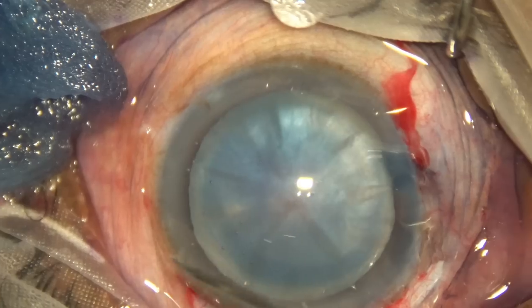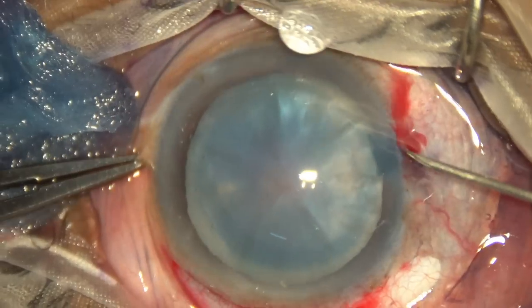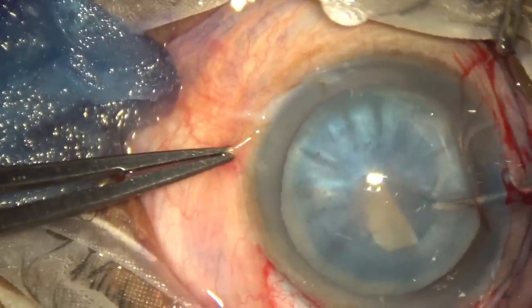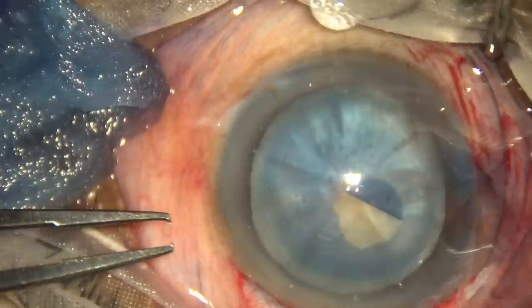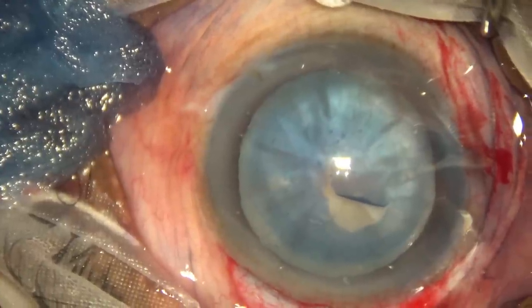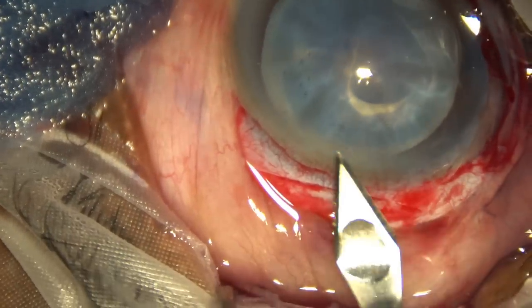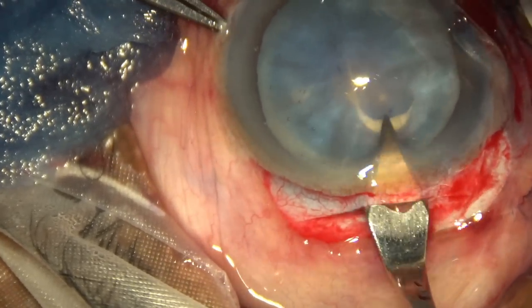Now we'll try to do a rhexis with this cystitome. The bent needle, 26 gauge bent needle, goes through the side port. So make an entry at the middle of this tunnel, go to the anterior extreme of the tunnel and make an entry of 2.8 millimeter.